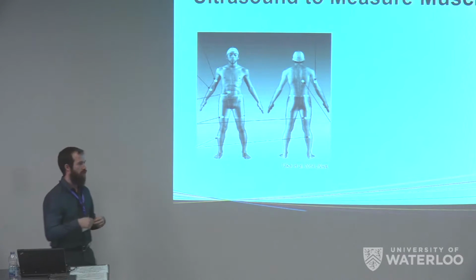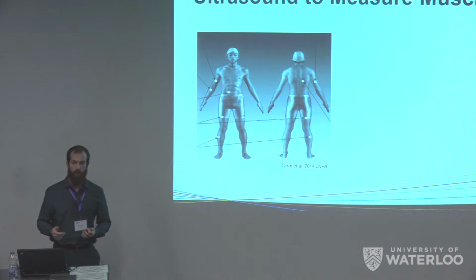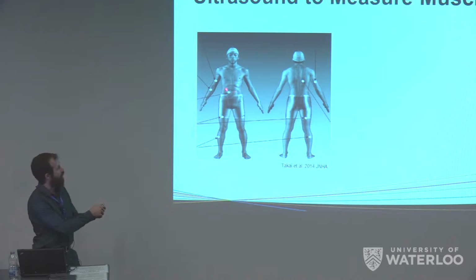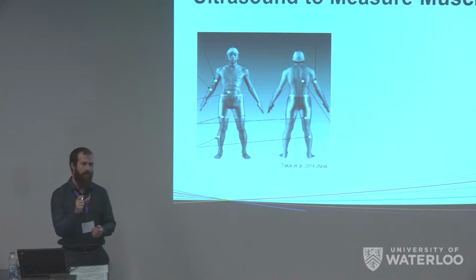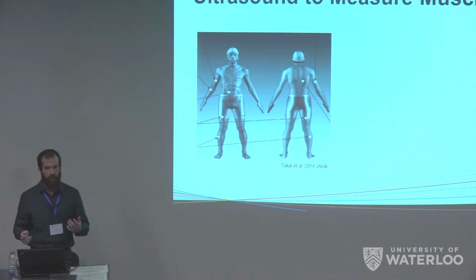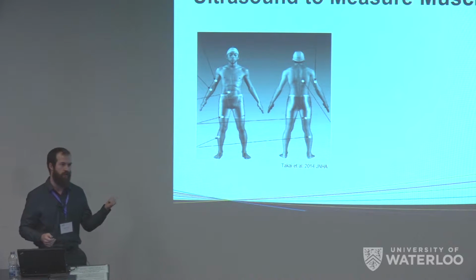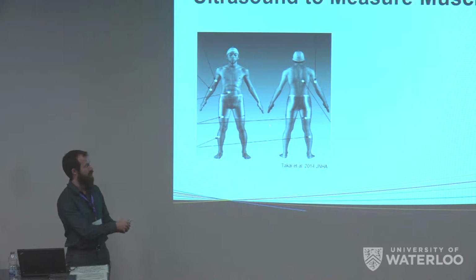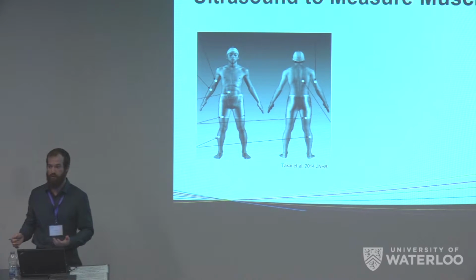And so if we look into the literature, the most comprehensive protocol we've come across so far is this 9-site protocol. And basically everywhere where there's one of those little white circles, you can take an image and you can take the thickness of the muscle from your pictures. And it's very, very accurate in predicting overall muscularity. But how feasible is this in certain clinical populations or during those times of catabolic crisis? It needs to be done in a standing position, and it's fairly time-consuming.